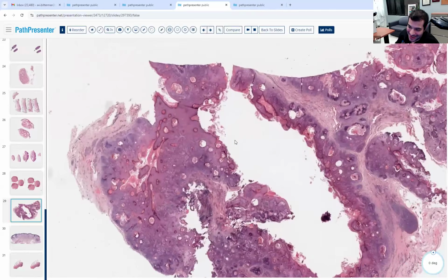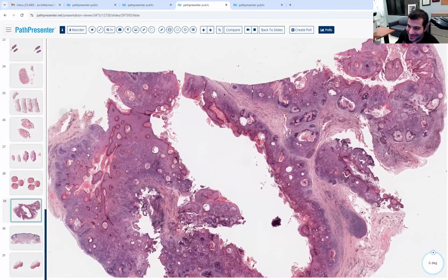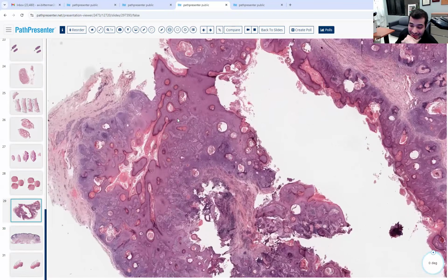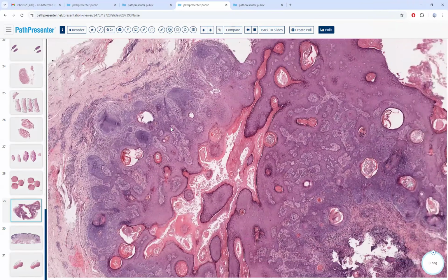We're getting to the end, just a few more. Big neoplasm, right? Yeah. Oh, that's a good point. Shane's saying they just lump them all together under tubular adenoma because there's overlap, so they don't differentiate tubular apocrine versus tubular eccrine. All right, maybe you might not be responsible for that then. Hopefully not. Hallelujah.